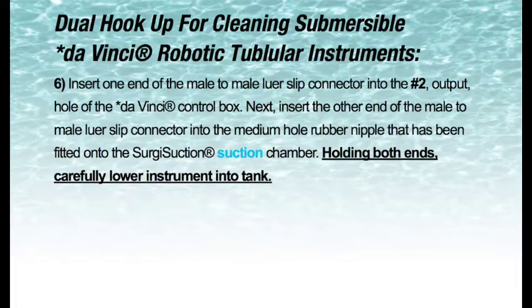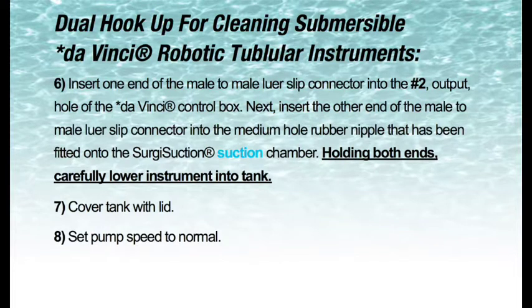Holding both ends, carefully lower instrument into tank. 7. Cover tank with lid. 8. Set pump speed to normal. 9. Set timer for 15 minutes.